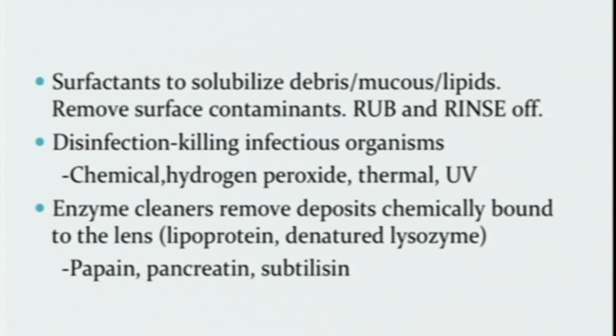The best disinfectant is hydrogen peroxide. At times it can be used, or change the lens, but examine the lens under the slit lamp if possible, if the patient gives any complaints regarding that.